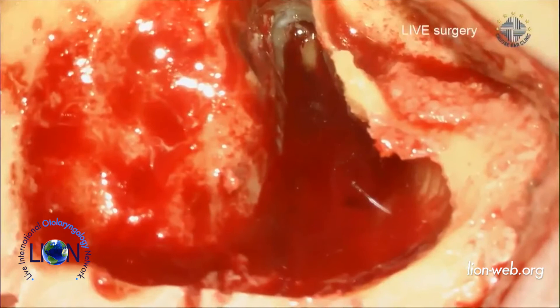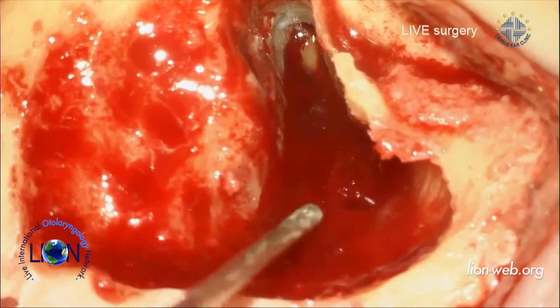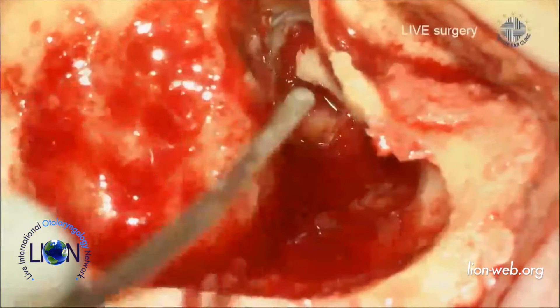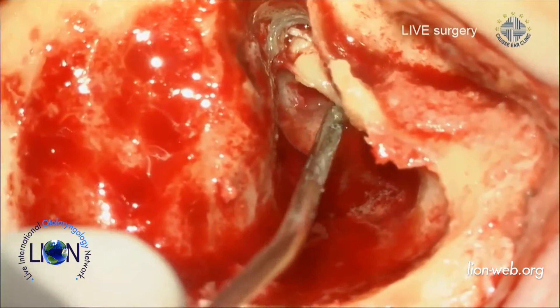Now I will first check the anatomical situation. This is a very small mastoid, so I performed a mastoidectomy with a posterior tympanotomy. As on the other side, the ossicular chain is complete, but was partially fixed by tympanosclerosis at the level of the fossa incudis. I removed this tympanosclerosis and now the ossicular chain is mobile.